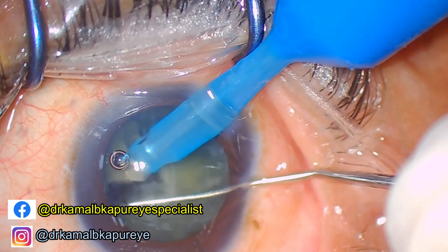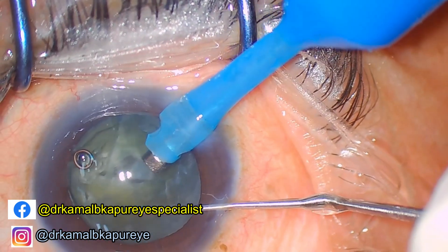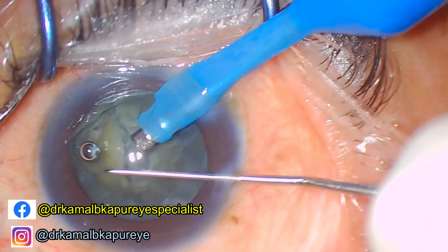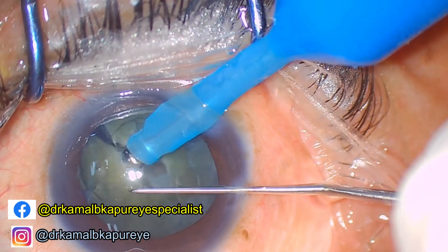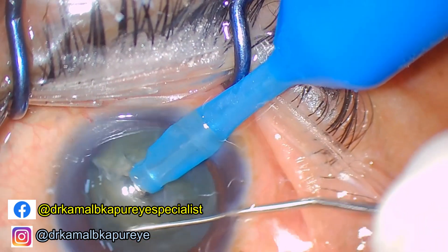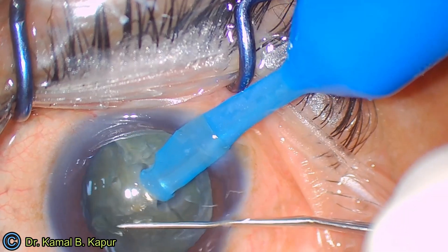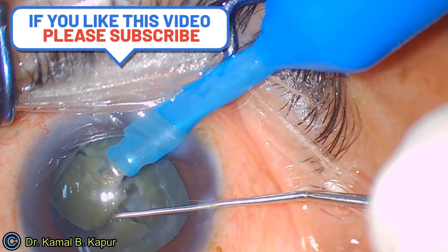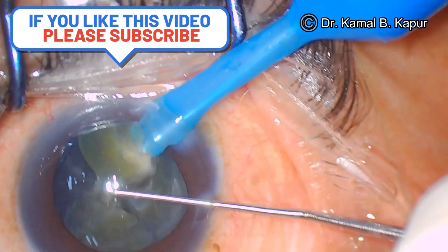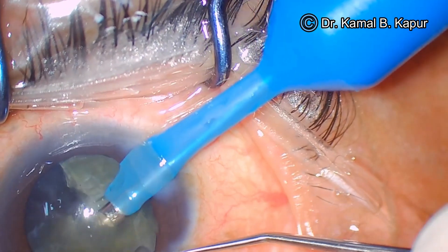This is another video where the cataract is slightly soft. We demonstrate a vertical chop, create the first D segment, and chop it into two. Now we embed the FACO tip in the middle part into the depth but the chopper is not in front of the FACO tip. See what happens — it creates a rotational force into the D segment and makes the chop ineffective. So chopping in front of the FACO tip is always more advantageous, ergonomic, faster, and more consistent.